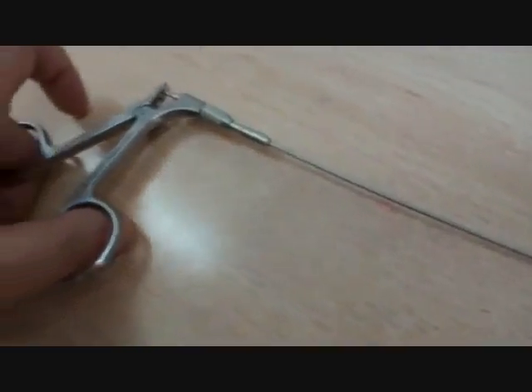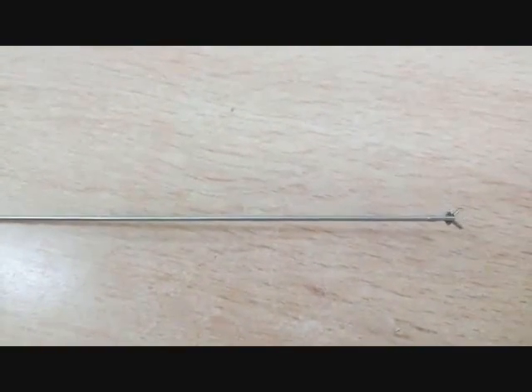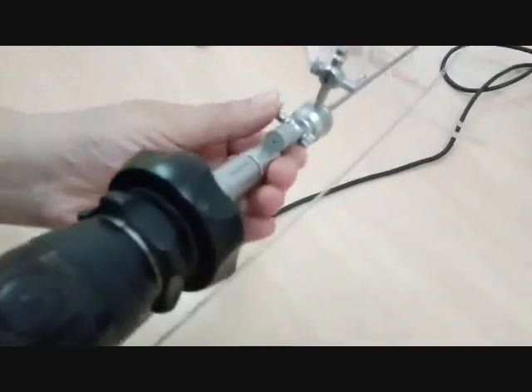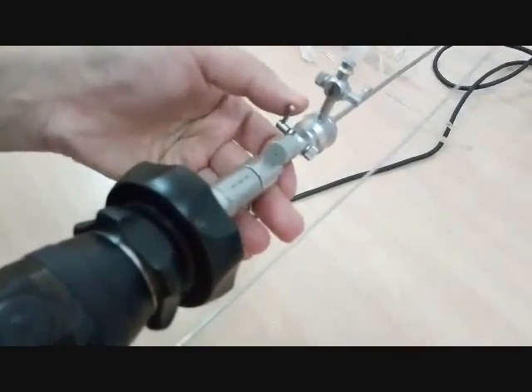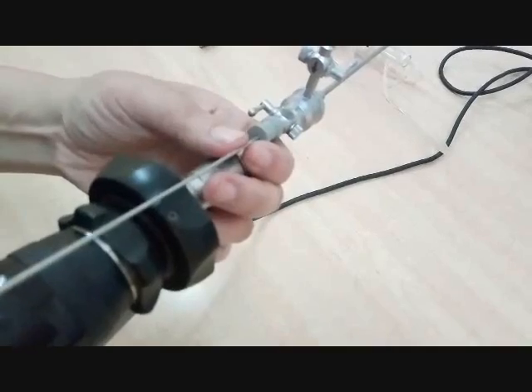See the other end of the instrument now. We open it and close, open, close, open, close. And you see on the other side, the forceps is doing the same. Now we want to insert an instrument. First thing, open the stopcock. Now the instrument can go through.